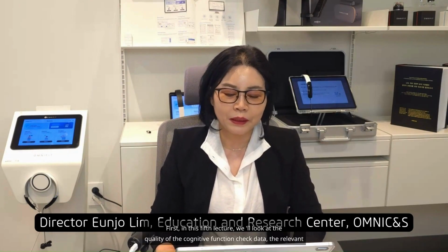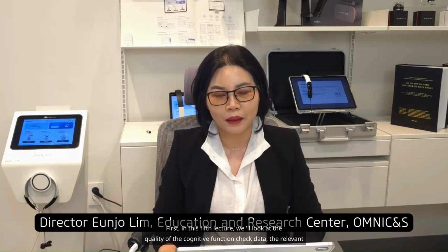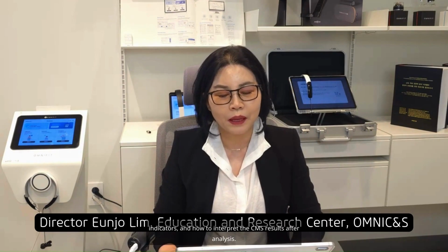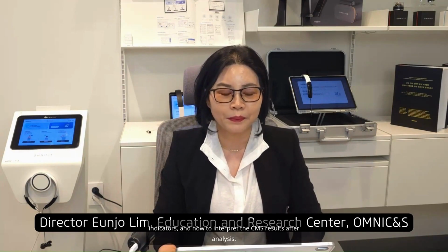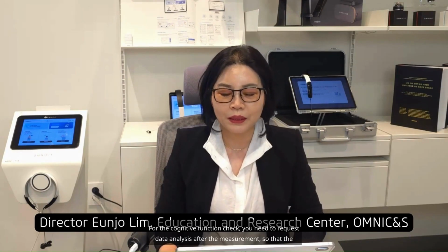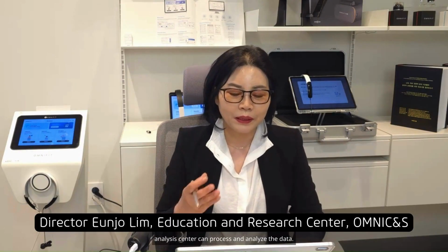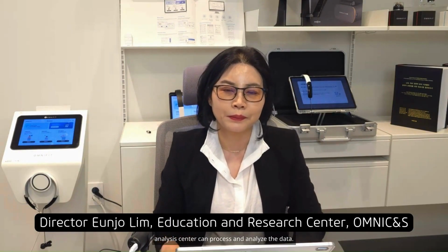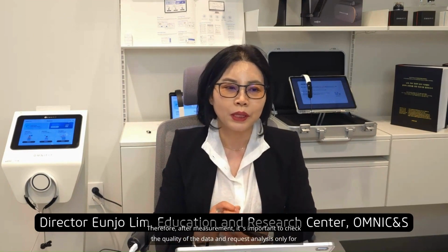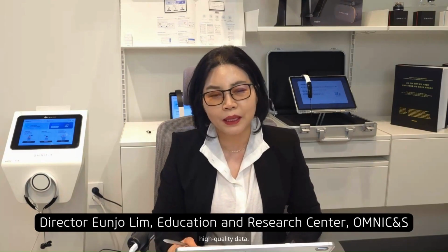First, in this fifth lecture, we'll look at the quality of the cognitive function check data, the relevant indicators, and how to interpret the CMS results after analysis. For the cognitive function check, you need to request data analysis after the measurement so that the analysis center can process and analyze the data. Therefore, after measurement, it's important to check the quality of the data and request analysis only for high-quality data.